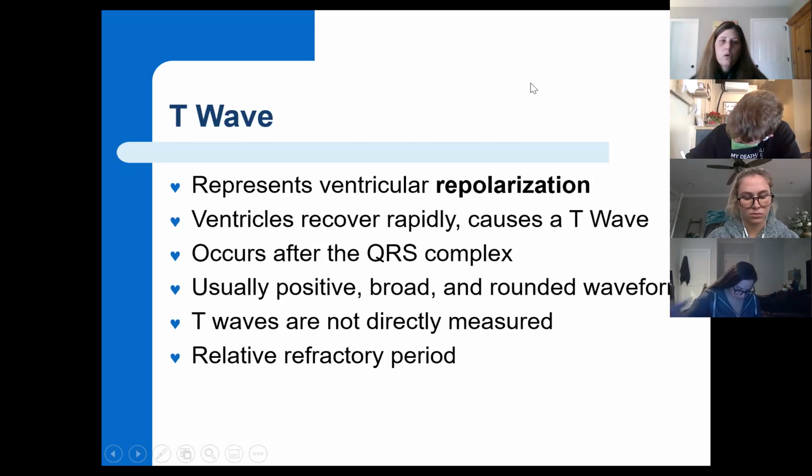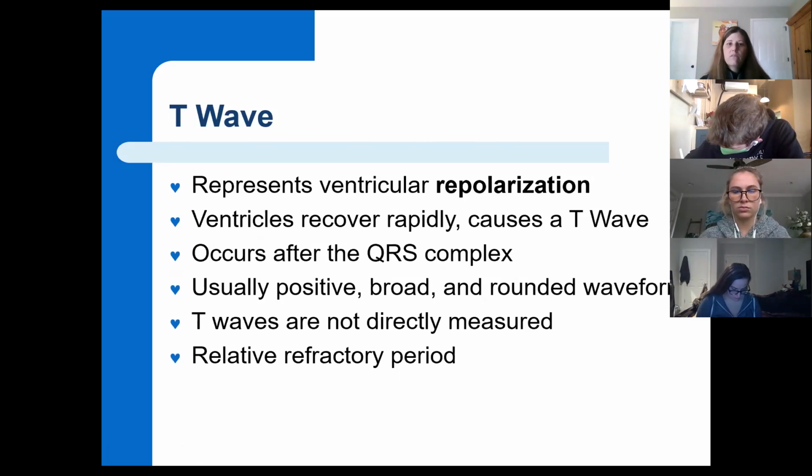All right, so moving on to the T wave. Again, we talked about this. That is the repolarization, the resting, the recovery, the refilling phase of the ventricles. They have just made this huge contraction during the QRS, and now they need to repolarize and recover. Okay?